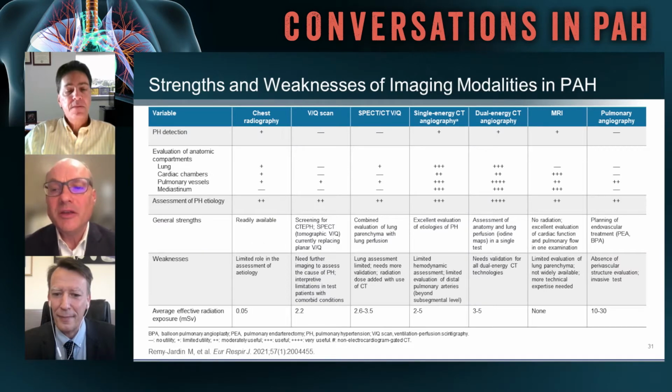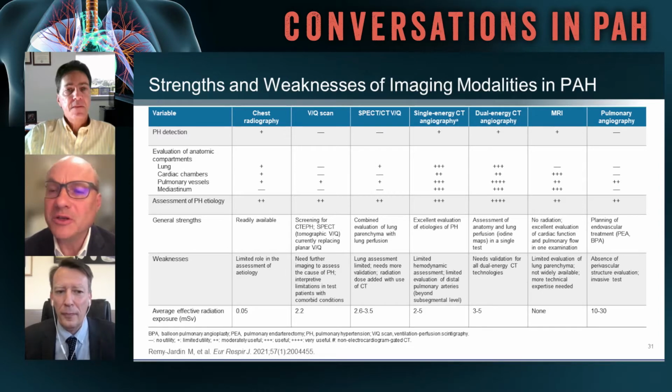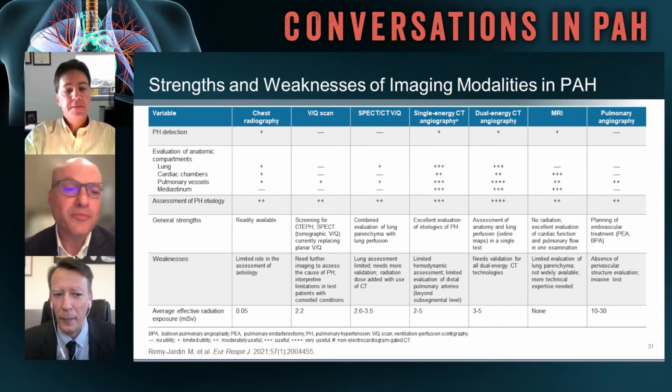Sure. So, we use standard echocardiography several times a year to monitor our patients. And as I mentioned before, we're able to do three-dimensional echo measures of RV function and strain, so we have been using that. One of our cardiologists, Dr. Joan, has been particularly interested, and then Dr. Burkett has looked at eccentricity index. Again, it's just something that is more objective. Then we use our standard other echo measures. So we do have a protocol for that, which I do think helps.